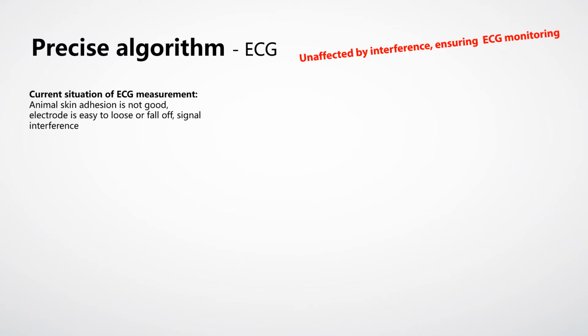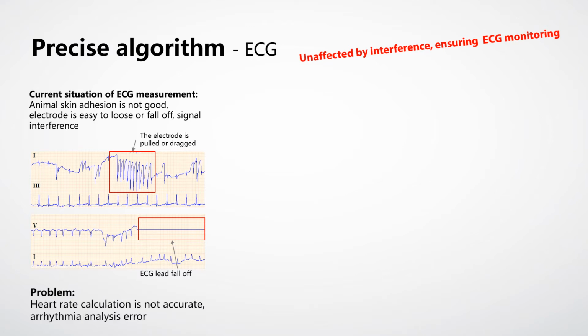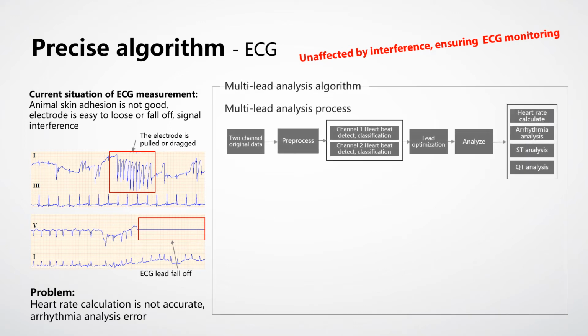For the animal skin, adhesion is not good, and electrodes are easy to lose and fall off, causing signal interference. This is the picture that shows the interference on the ECG monitoring. And when the ECG lead falls off, we can also see a flat line in the ECG waveform area. All those problems will cause the heart rate calculation to be inaccurate and the arrhythmia analysis to be in error.